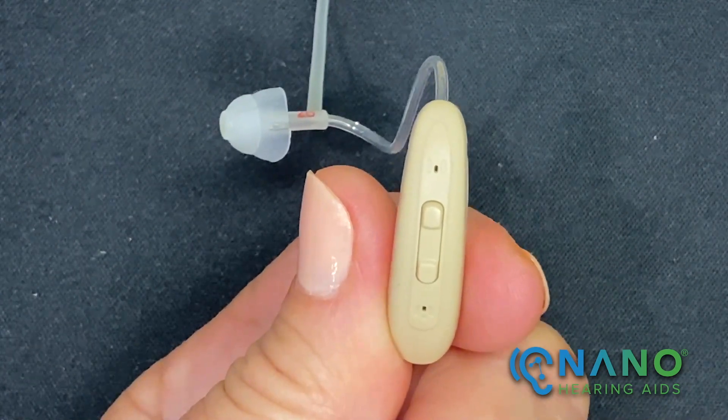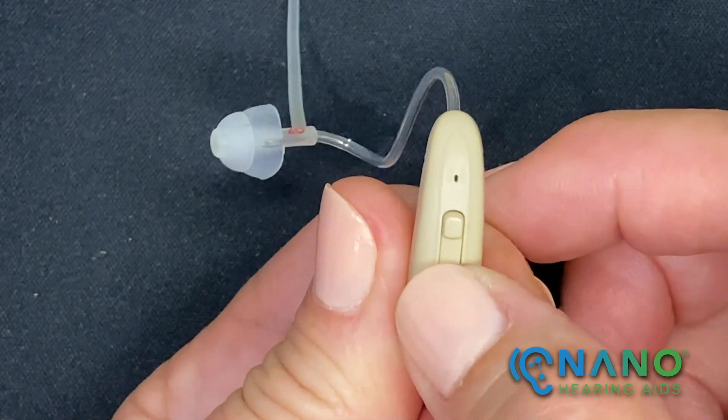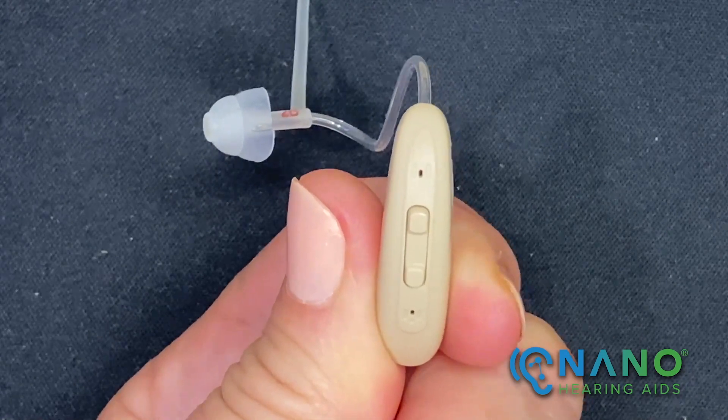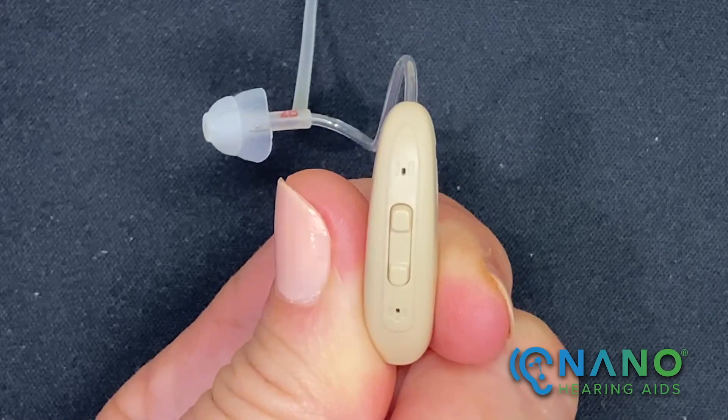To turn the hearing aid on, press and hold the lower button for three seconds. The aid will power on to the last program used. You'll hear one beep for program 1, two beeps for program 2, and so on.